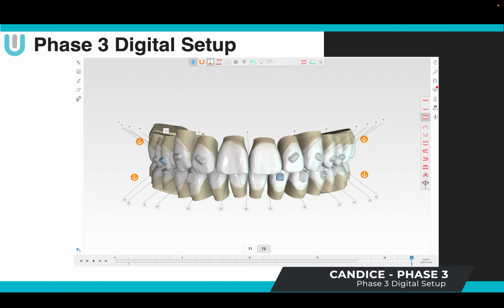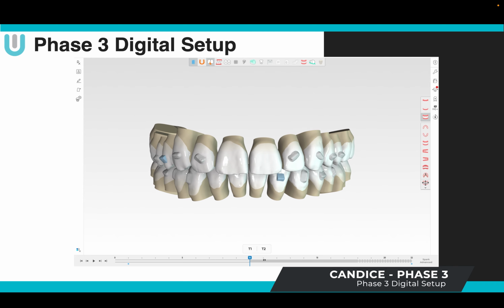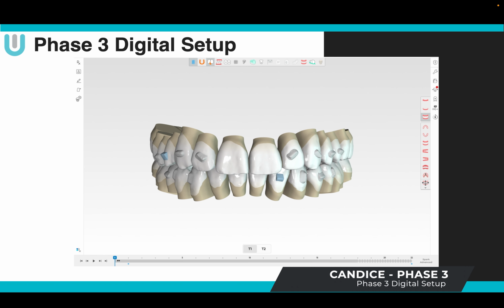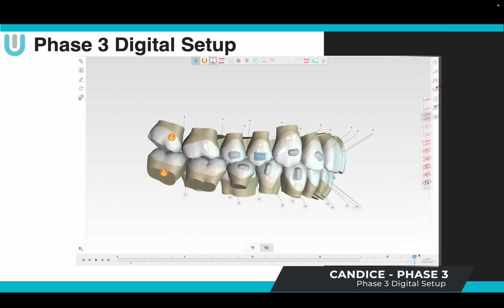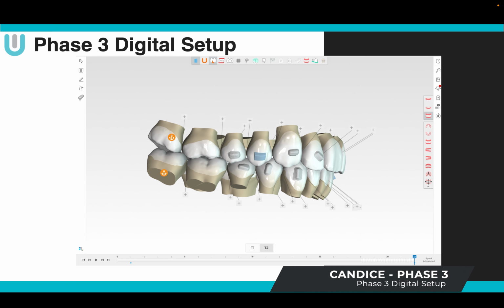Because I want a line of force acting on the flat spot of that attachment, which is going to help with the buccal root torque and lingual tipping. Again, it's a force diagram that's pure. It's hard to argue. So as long as the tray is tracking and fitting, that works really, really nicely. Again, we're settling that occlusion, rotating those lower canines, and just doing the small details.